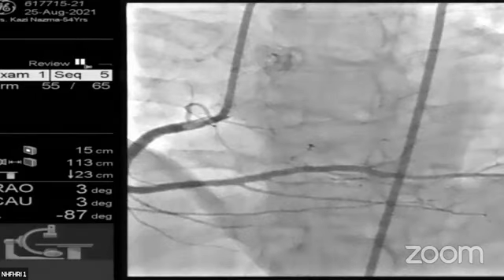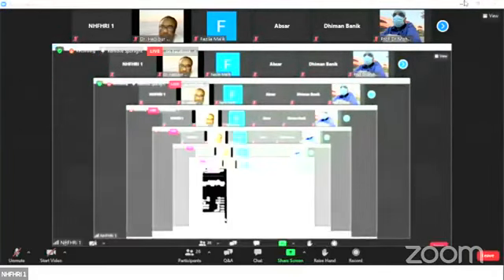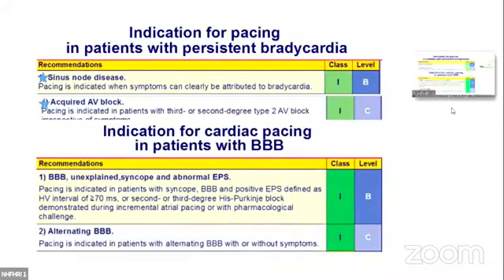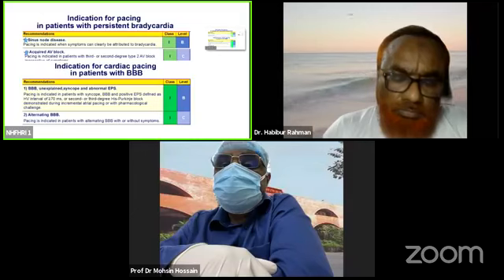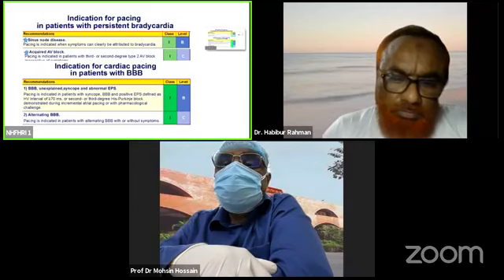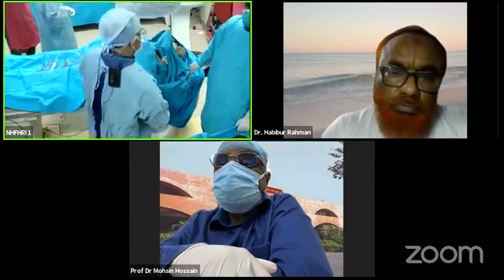And how to do the pacemaker? We have to go through either the cephalic vein, axillary vein or subclavian vein. For the cephalic vein, by venesection, we give the incision, find the cephalic vein, then cut down on it, and through it we usually introduce the lead. And nowadays, frequently we do a subclavian or axillary puncture.